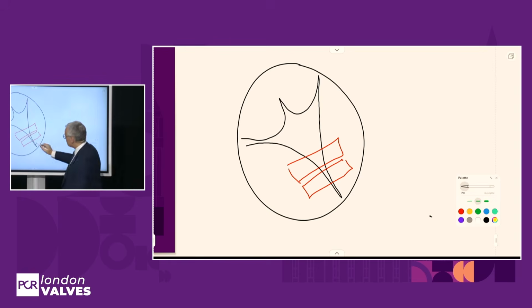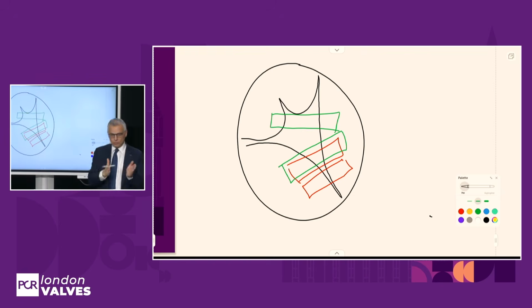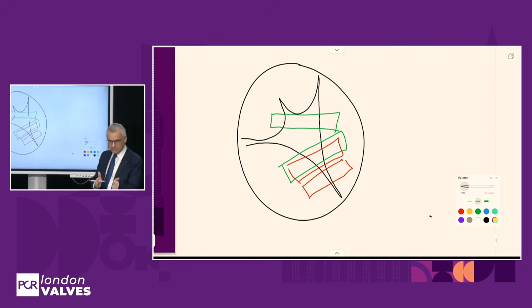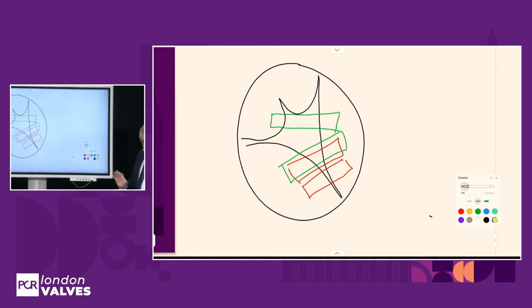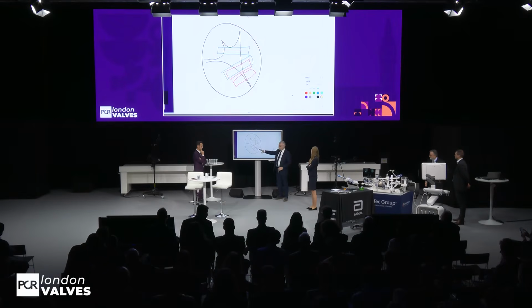The other option would be a clover, where you have 2 clips implanted, one anteroseptal, one posteroseptal. That is for the 2/3 of the audience who didn't raise hands. Maybe some of them don't know. Well, I would like to discuss with you. So what would be your choice for the second patient? I mean, this one or this one?